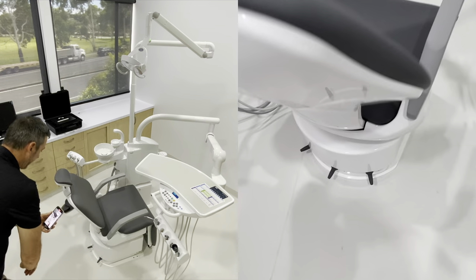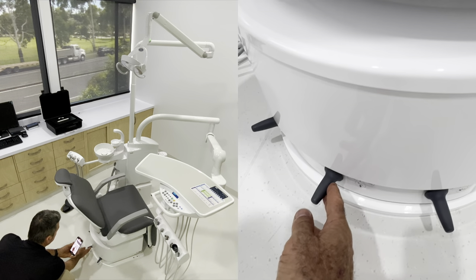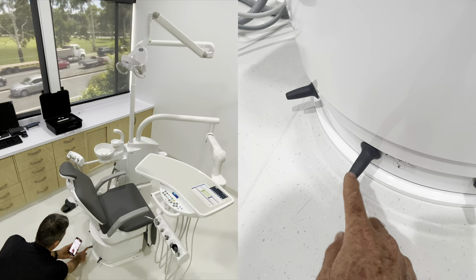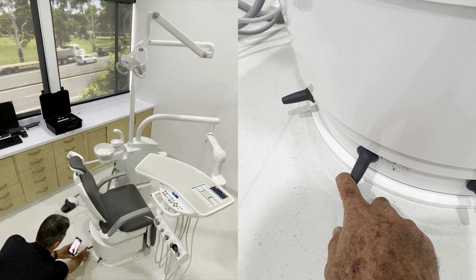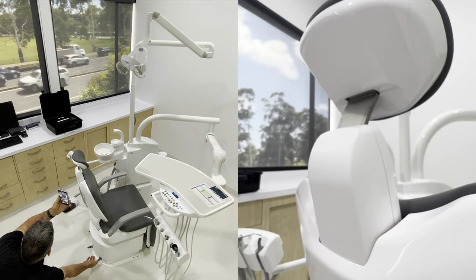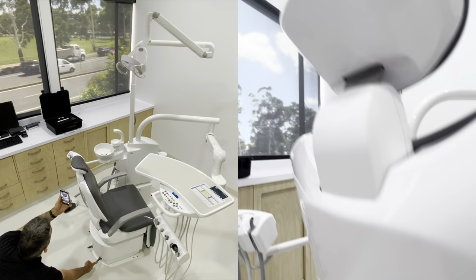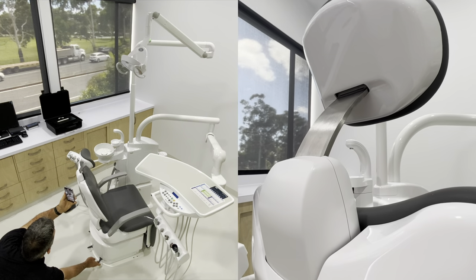While we're at it, we might as well go to the toggles down here. We've got those same movements replicated on this toggle which is usually controlled with your foot - chair up, chair down, back rest back, back rest up. These ones here are our head rest controls. Push up for head rest up, push down for head rest down, sideways brings the head rest down, and the other way to the right takes the head rest forward.